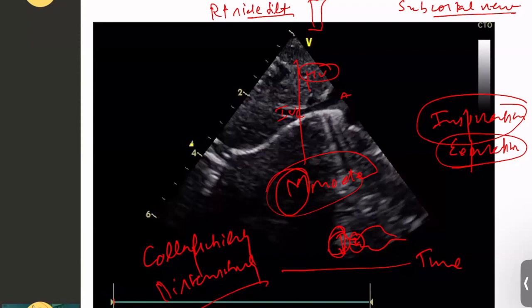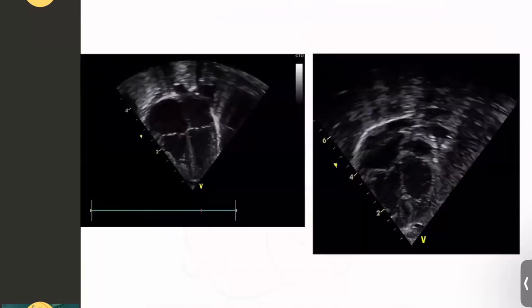Let me give you an example. We looked at, that is right now not published, but we are going to publish soon, 500 babies. We thought that in newborns, let's first see how much is the average diameter. So in spontaneously breathing, healthy, late preterm and term babies, we assessed within the first 6 hours how much is the IVC diameter. It's very, very narrow. So we need more research in the newborn period before we jump upon giving fluid boluses based on the IVC or restricting ourselves.